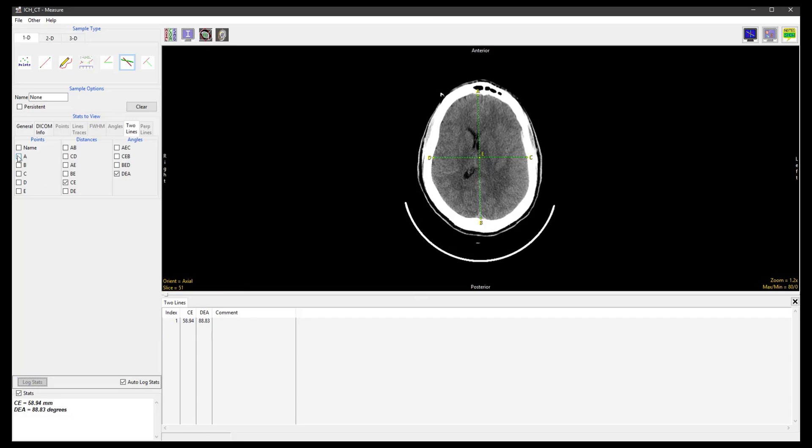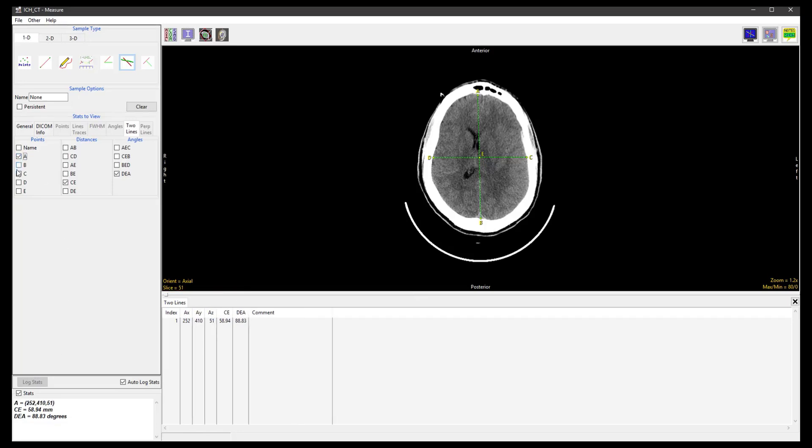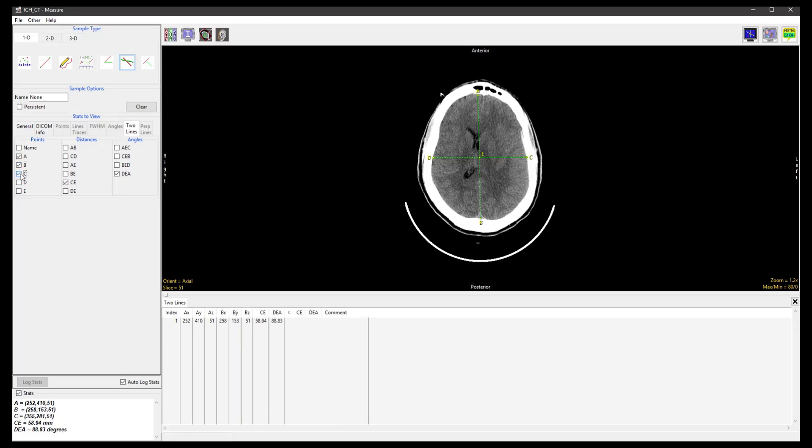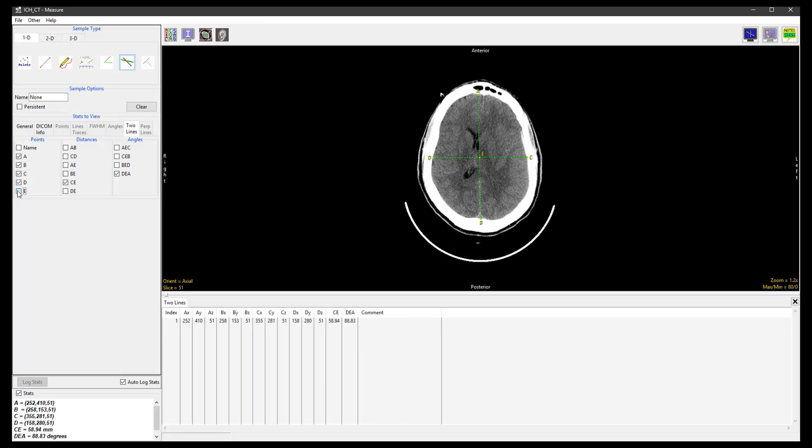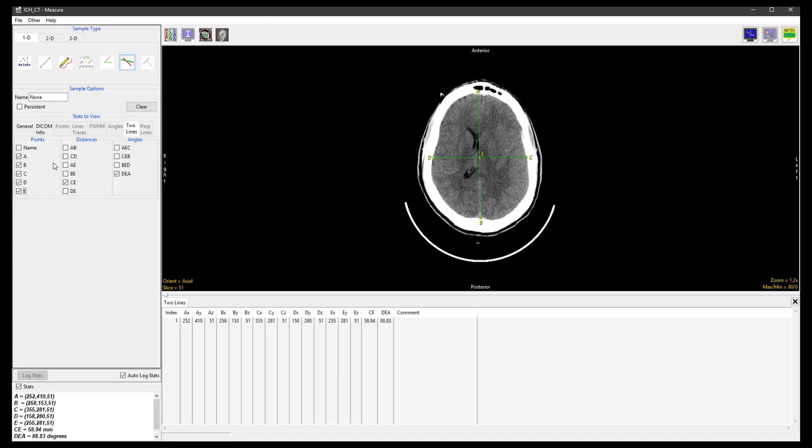Returning to the Stats to View panel, we can select any of the points, distances, and angles, and these will automatically appear on the Stats Log.